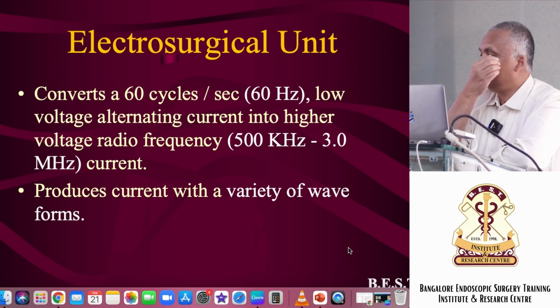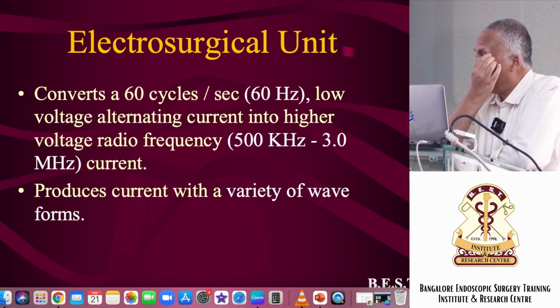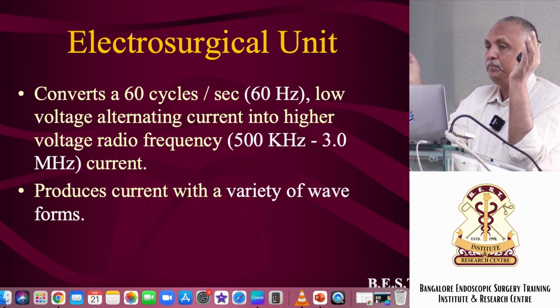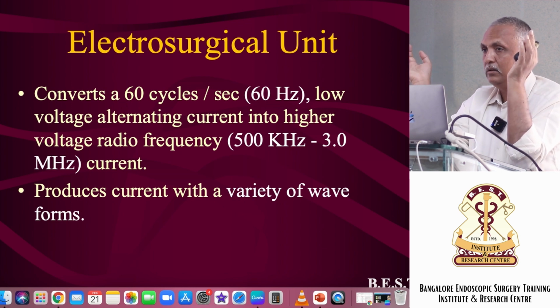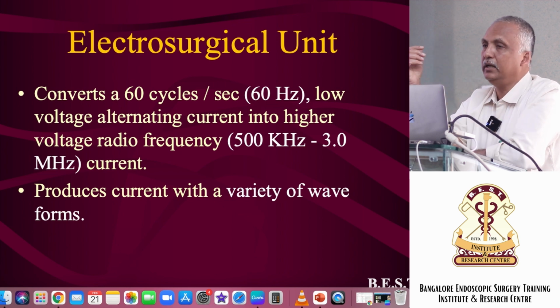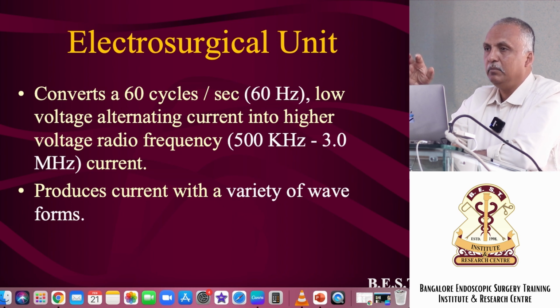Now, let us come to the diathermy machine. One of the first machines that came was so bulky, it was occupying a whole room. And then they started making machines smaller and smaller, and today you have such beautiful machines. But what do these machines do?